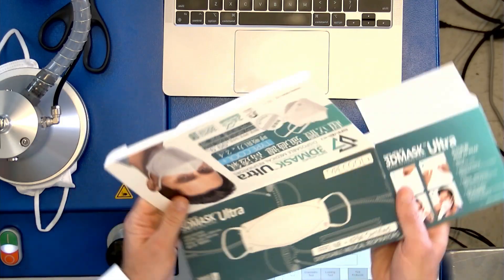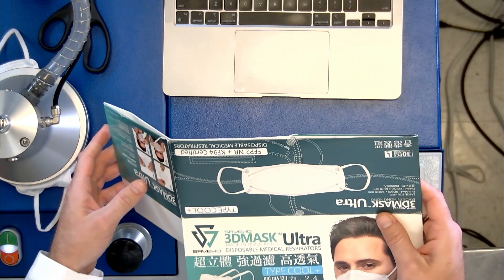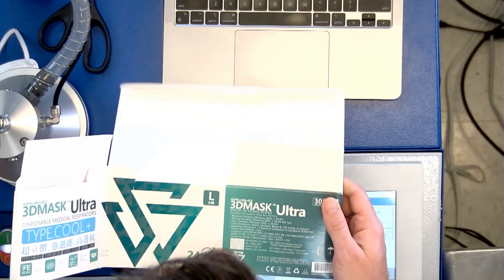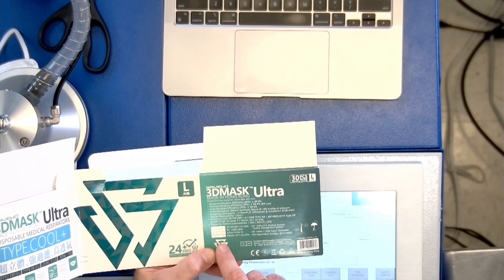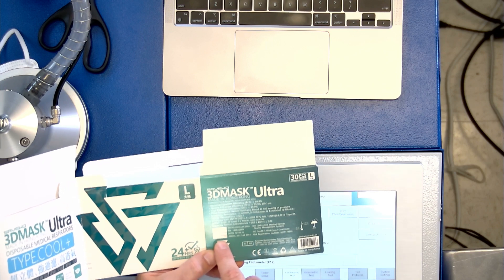This is the Save Woo 3D Ultra, made in Hong Kong. It's claiming FFP2 and Type 2R, which is a surgical mask standard, as well as Level 3, which is also a surgical mask standard — those are European and US standards. And they're also claiming KF-94. Let's go ahead and try this on.